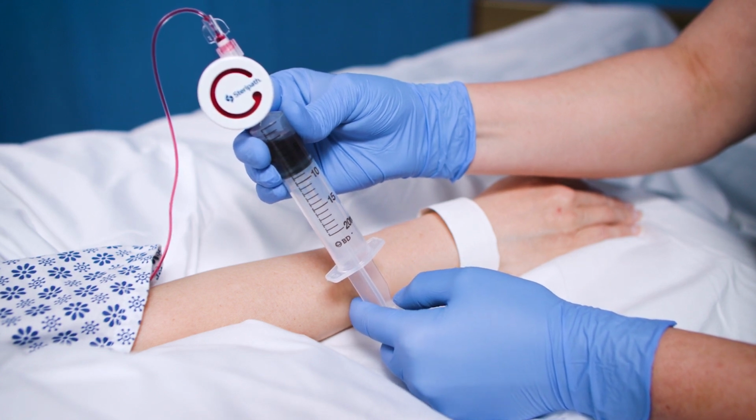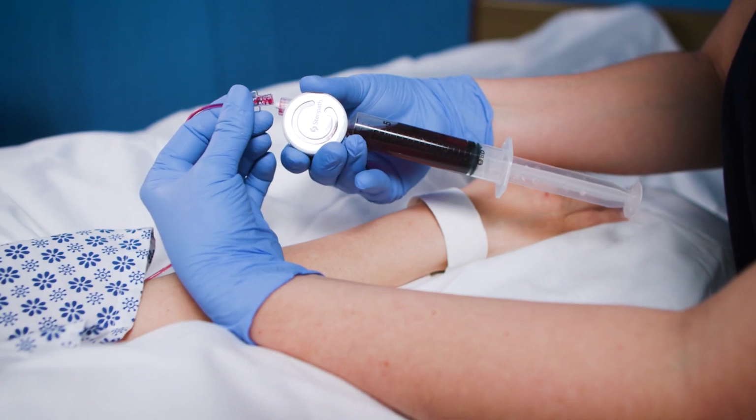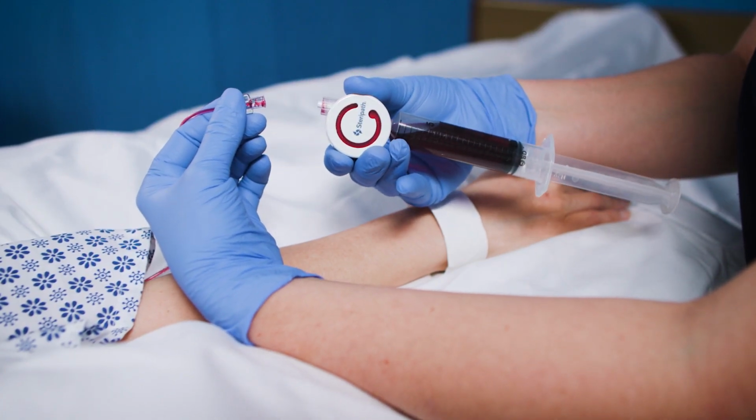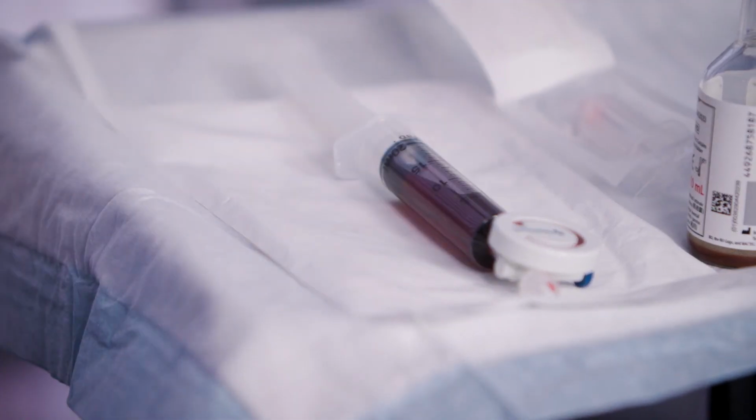After collecting blood culture sample, pinch clamp to occlude tubing. Disconnect Steripath Micro with syringe attached. Place device on sterile packaging. Be sure not to push syringe plunger.